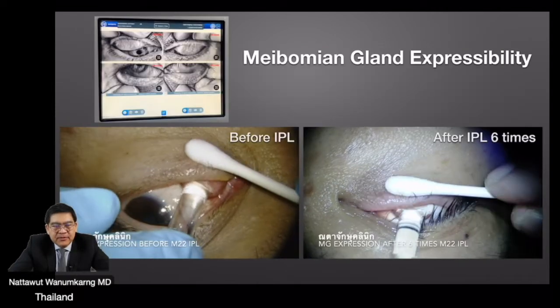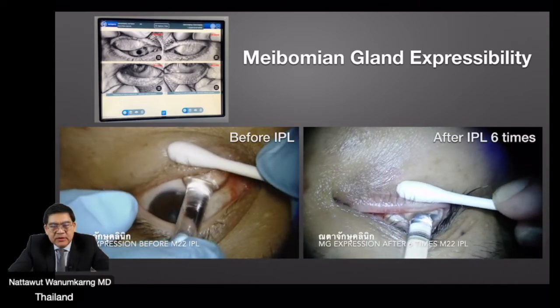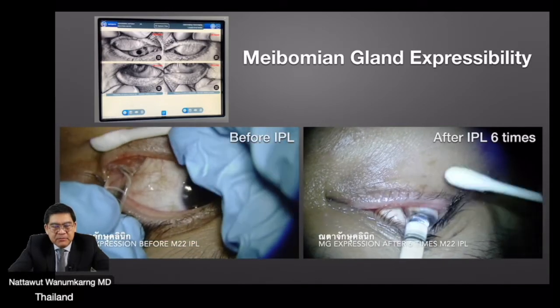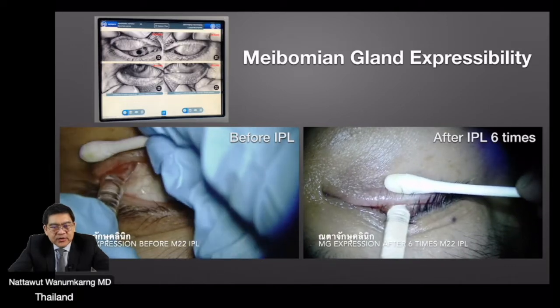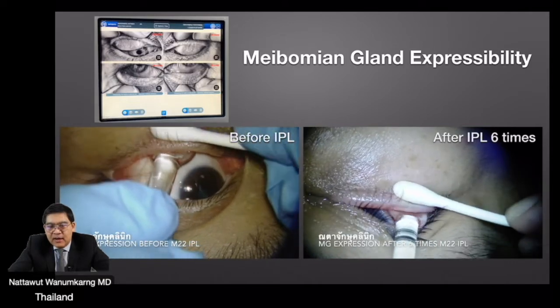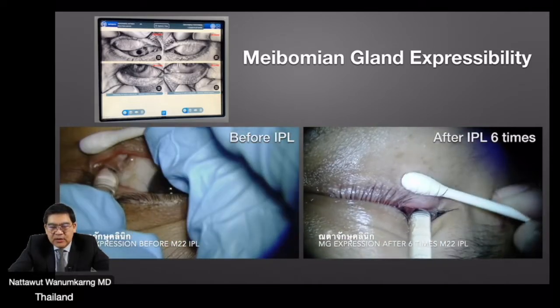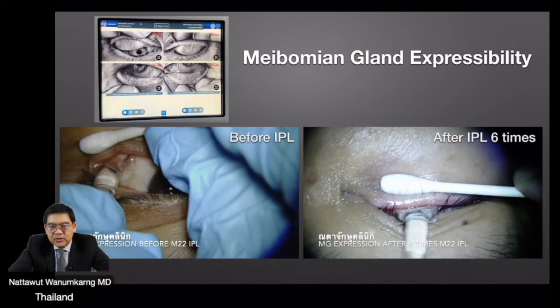On the left-hand side, before the IPL, the meibomian gland content is quite turbid, and sometimes it is like toothpaste-like content, and it is quite difficult to express the content from the gland. On the right-hand side, after 6 IPL treatments, we can see that the content of the gland is clearer and much easier to express.